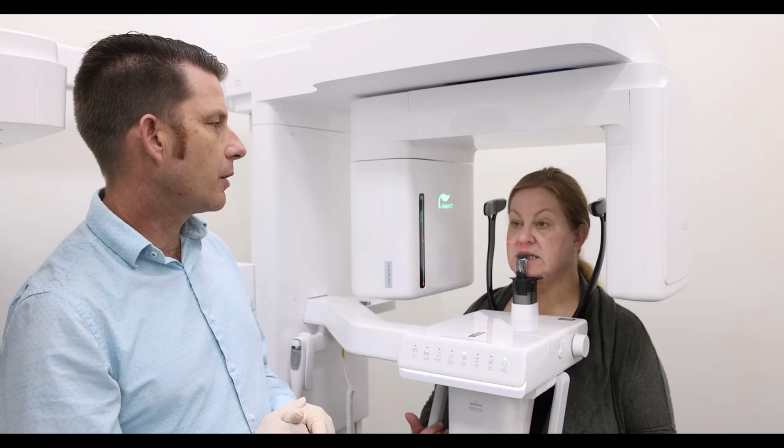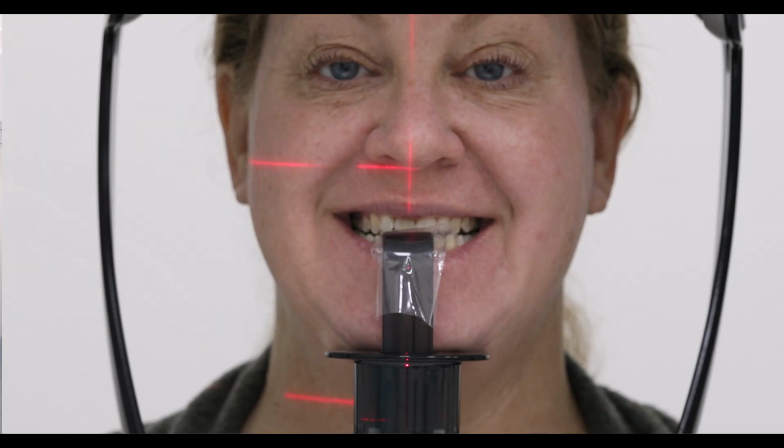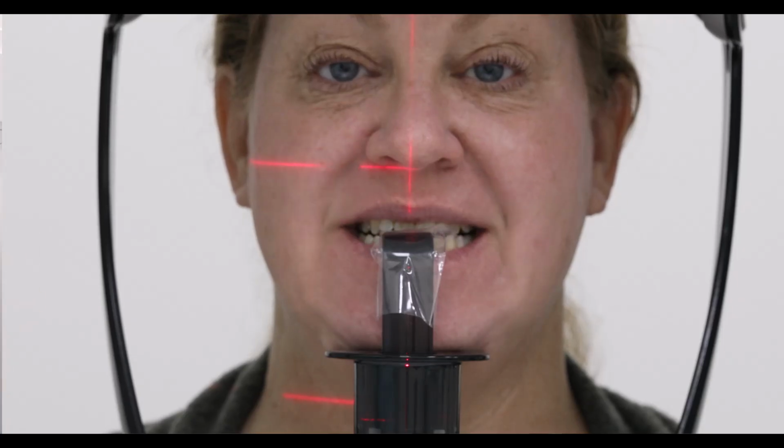I have my patient biting on the bite stick. I have my patient smile really big for me. I can see the occlusion is flat or parallel to the floor. You can relax your lips.